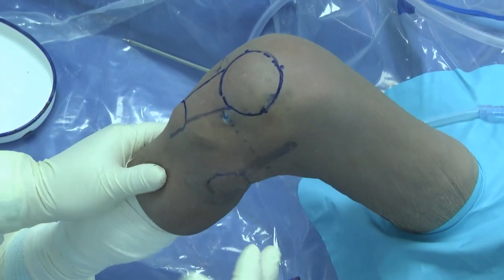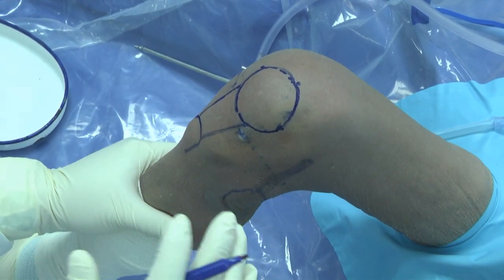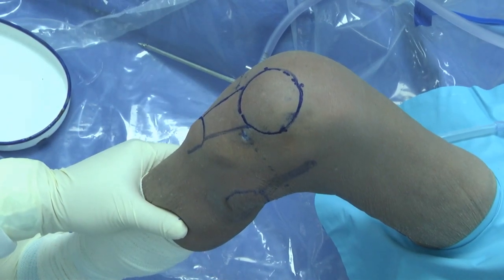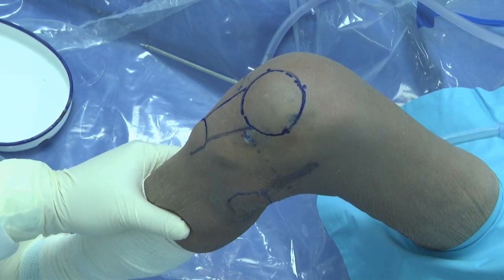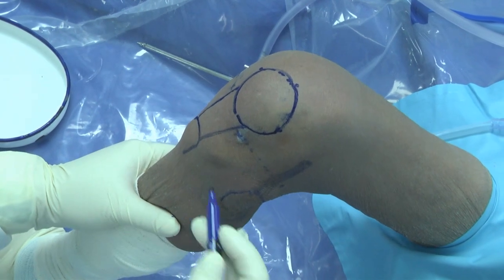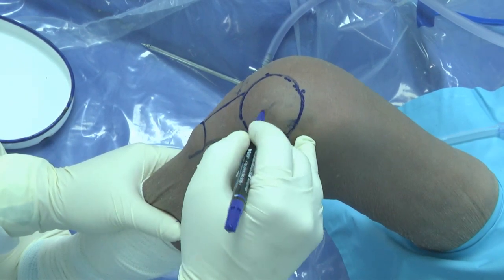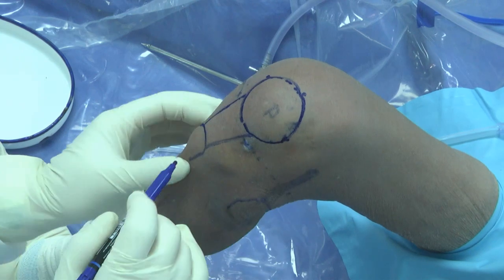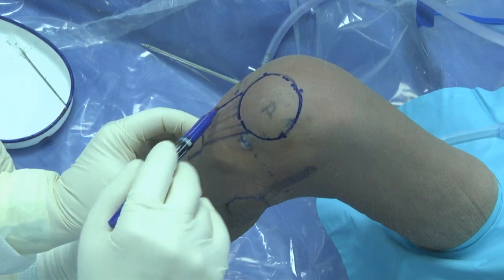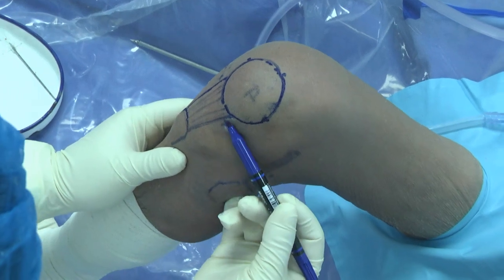So I think first we are going to the very simple anatomy and portal placement. But this is very important for the arthroscopic surgery. 好，那我们就开始了。先讲通道的设置，这个是非常重要的。So this is the left knee. 现在看的是左膝。So you look from this camera. This is the kneecap, patella. 髌骨。And this is patella tendons. 髌腱。Tibia tubercle. So this is the lateral joint line.